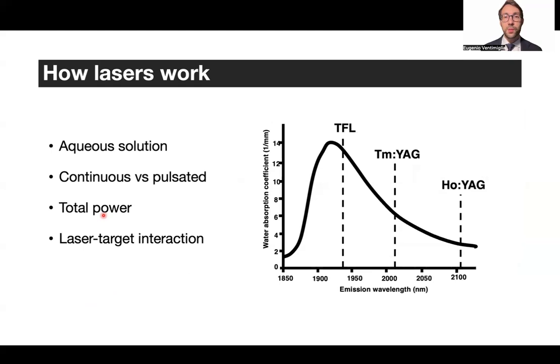A few key concepts which I think are really useful to understand in order to realize how these lasers work are basically that the endourological lasers are applied in an aqueous medium. They work in the water. And each specific laser is characterized by a specific and different absorption by water. Holmium YAG is absorbed quite decently by water, but thulium YAG and thulium fiber lasers are absorbed at least 2 times to 4 times as much.